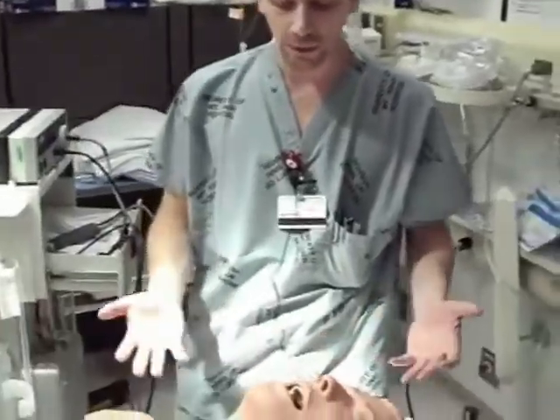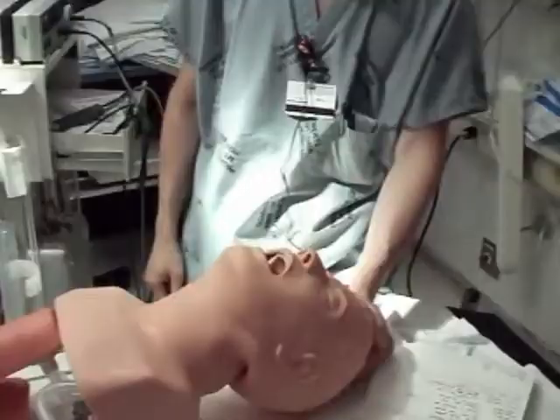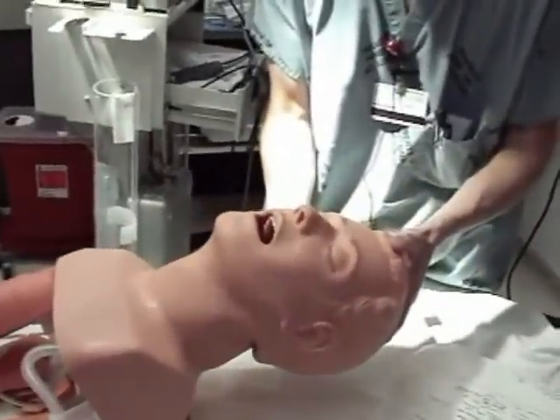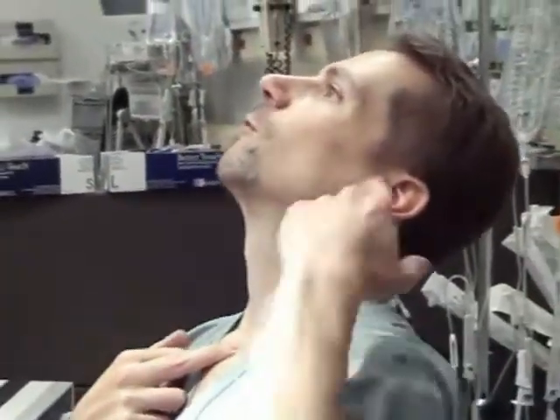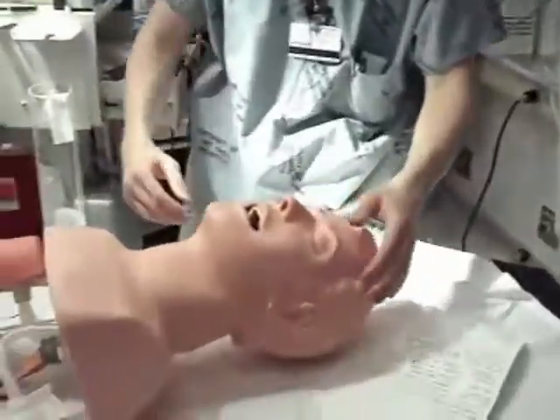How do we know on a mannequin or on a patient what good and bad sniffing position is? There is an objective way. If you look at your external auditory meatus, it needs to be on the same horizontal plane as your sternal notch. So the ear hole is at the same plane as the neck hole. Instead of the ear hole all the way back and the neck hole up front, we want ear hole and neck hole on the same plane.